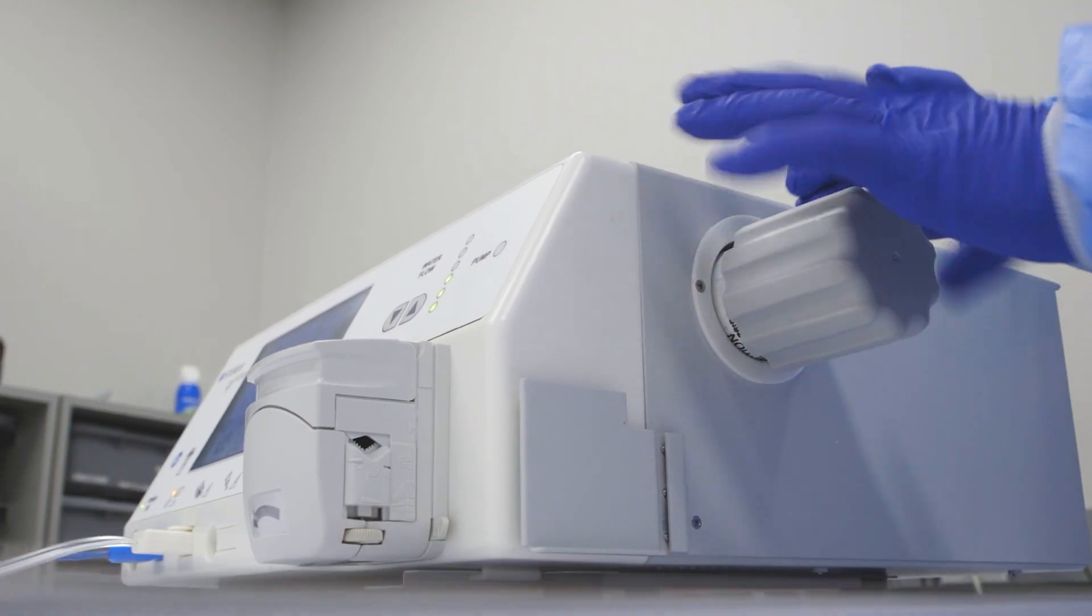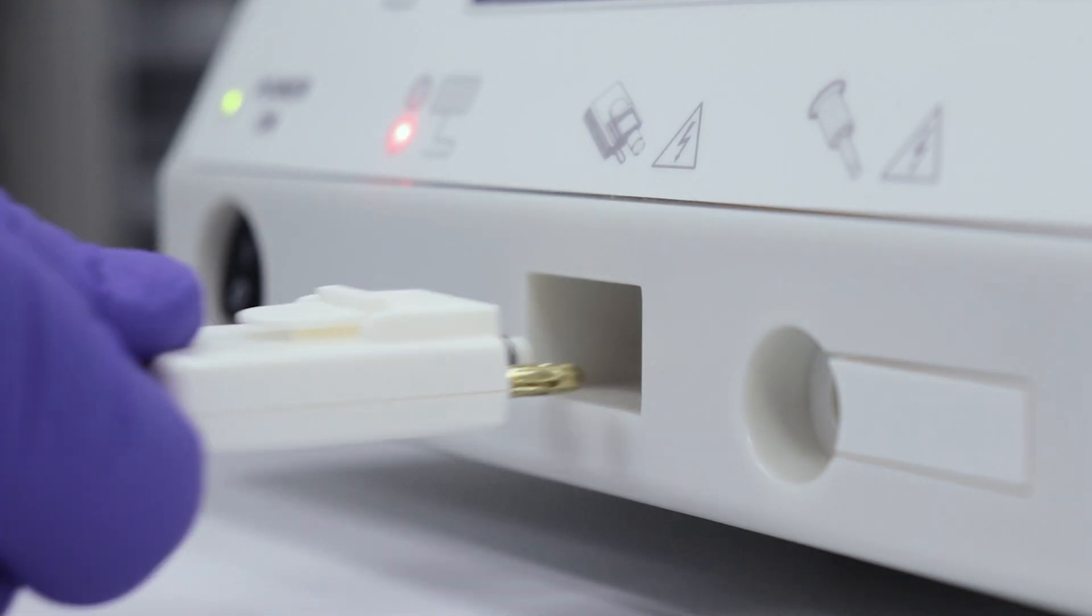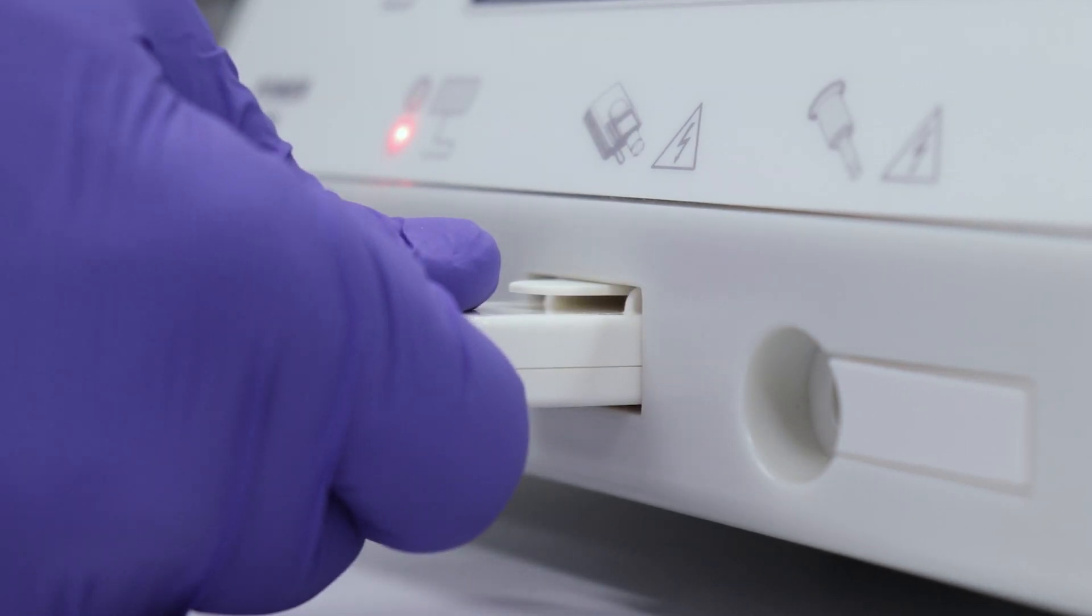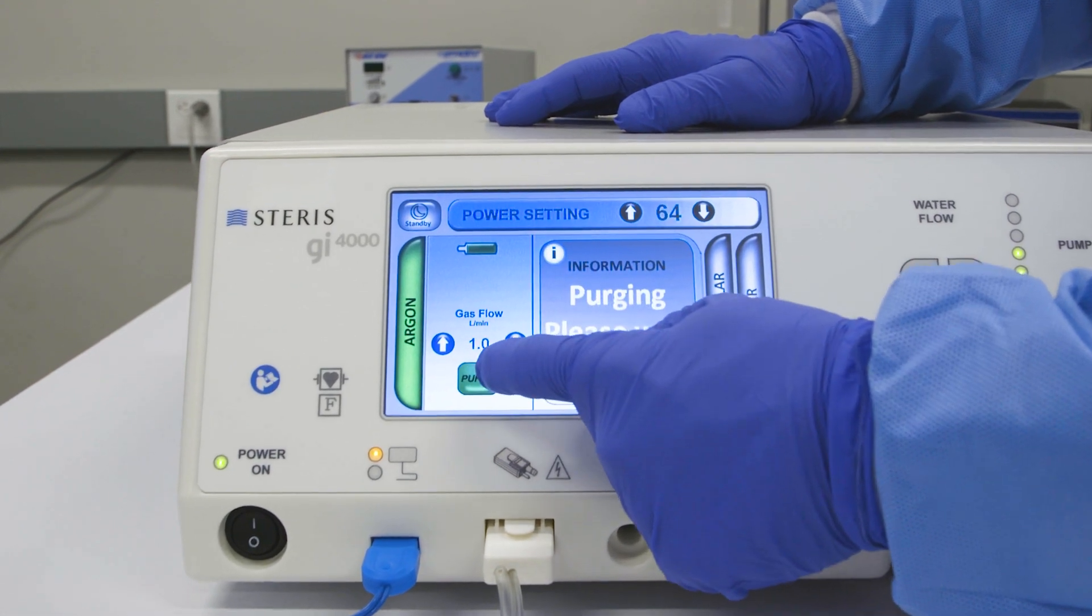Once the new argon gas bottle has been installed, you may reconnect the ArcConnect to the receptacle and re-pressurize the argon gas line by purging.